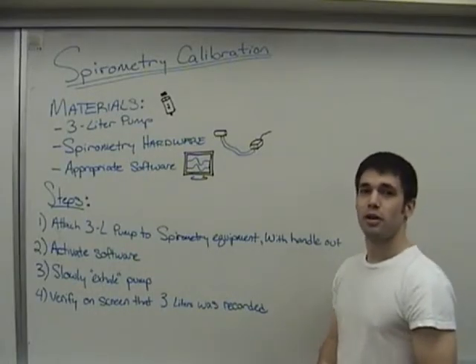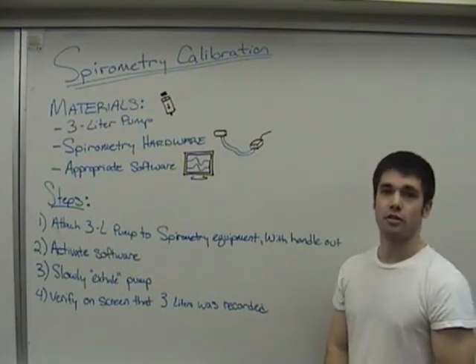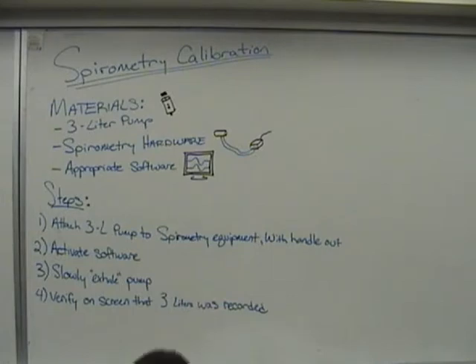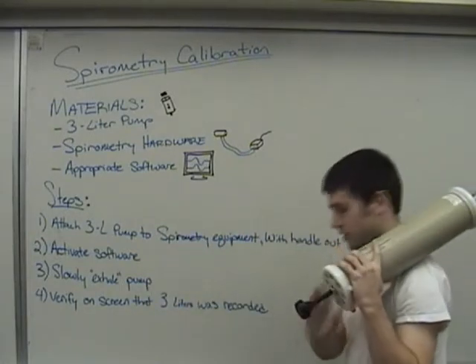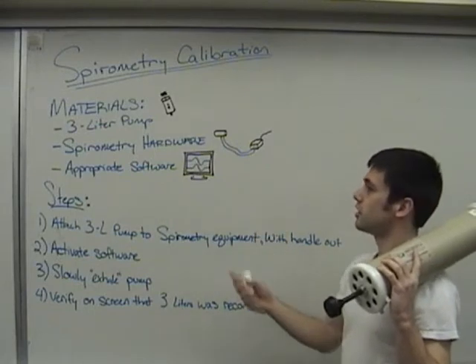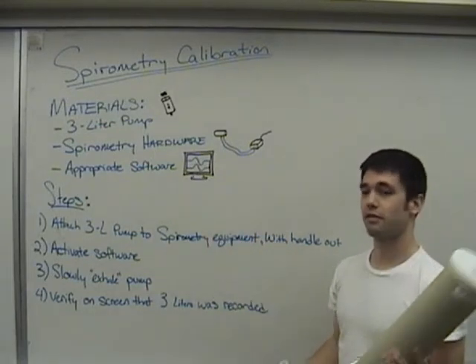An important part of doing your testing is making sure that your equipment is calibrated. For spirometry calibration, we're going to need three items. First is a pump. Next, you will then need spirometry hardware and appropriate software, which we happen to have in the computer lab.